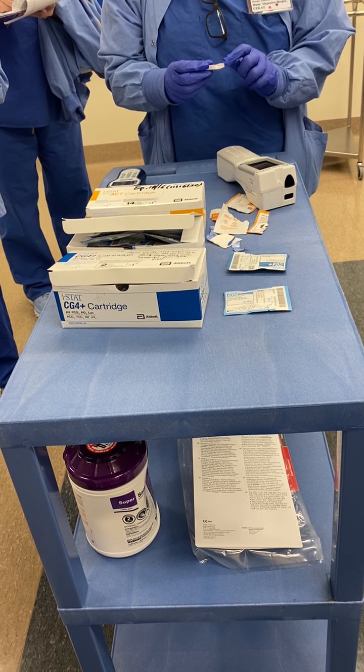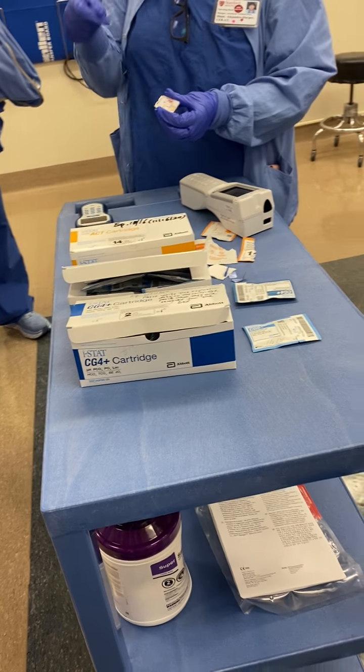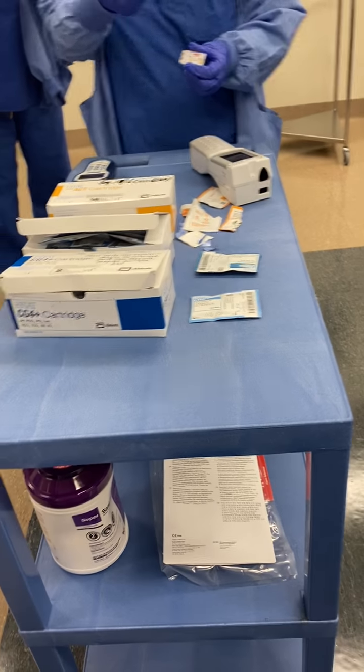And then you need to be able to drop blood. You get the blood from the arterial line, your art line transducer, the little plunger.